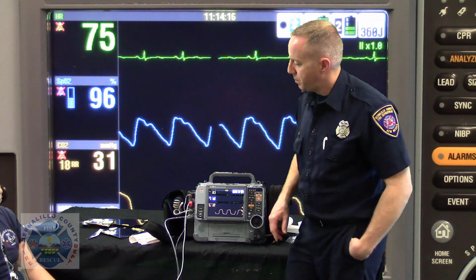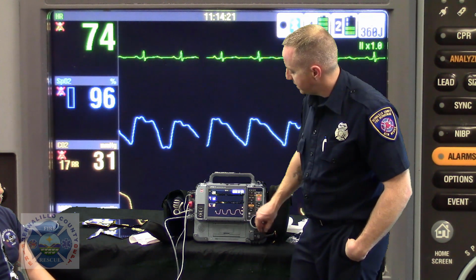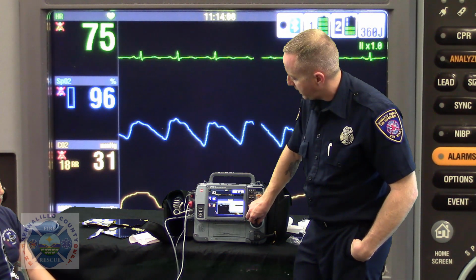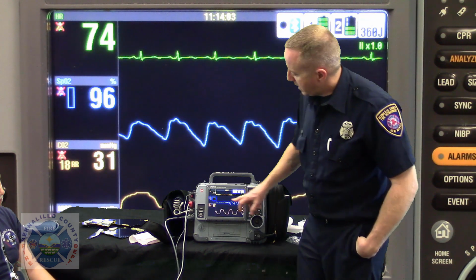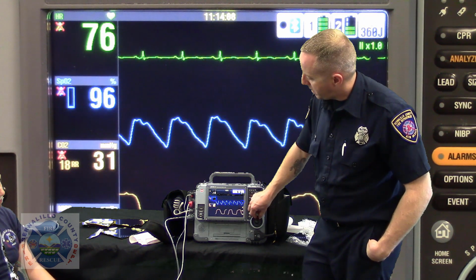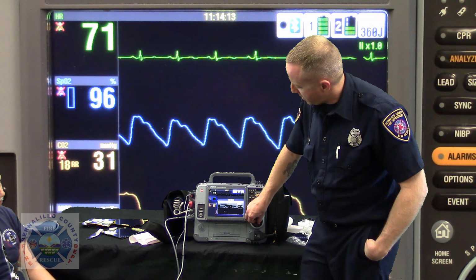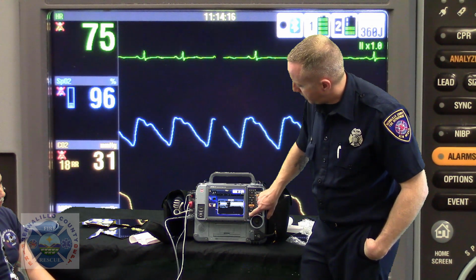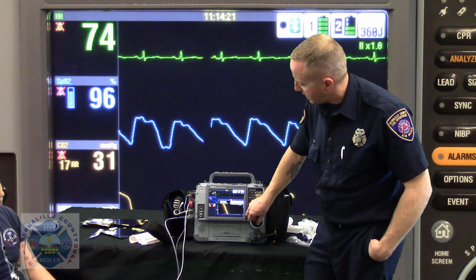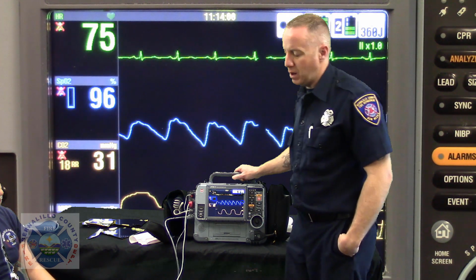And I've introduced my SpO2, and I want to see if I'm oxygenating well as off-gassing CO2. I can go back down here and change my waveform from EKG to SpO2, and notice how this changed color from green to blue, and that graph is in blue on the SpO2. So if I wanted to turn off the volume on my pulse oximeter and rather listen to the EKG, the QRS volume, I'm going to get the same result. I'm going to hear a beeping heart rate.